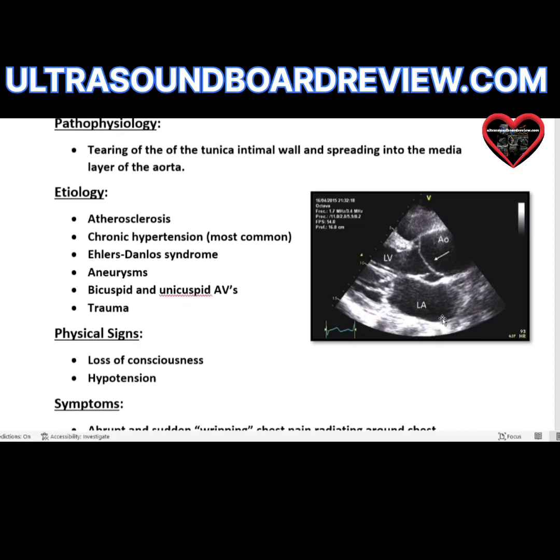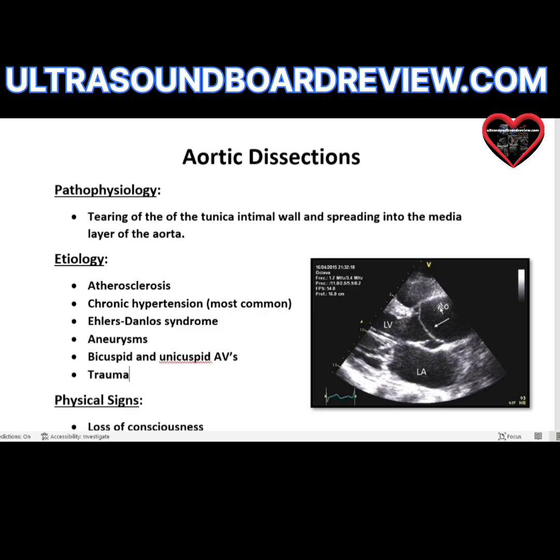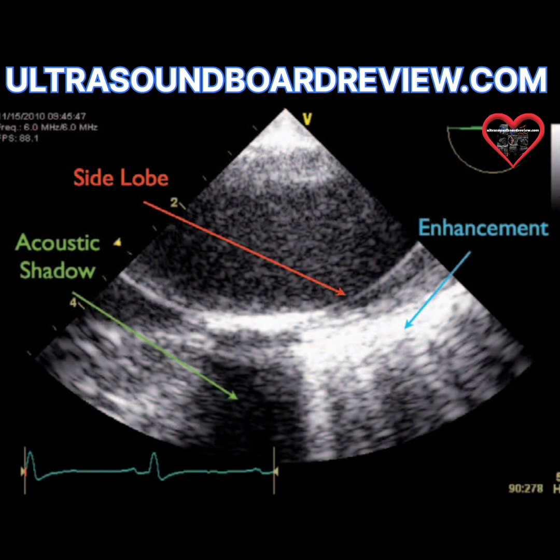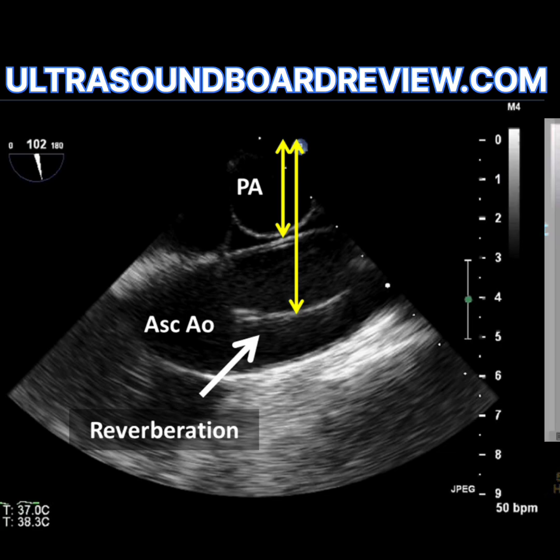In this image you can see part of the wall that's torn. It's hard to tell from just this view which side the dissection is on, but you can definitely identify a dissection from the intimal flap. There are artifacts that can mimic a dissection that you need to know — the first is called a side lobe artifact. Side lobe artifacts are known to cause suspicion of dissections, as does reverberation artifact.